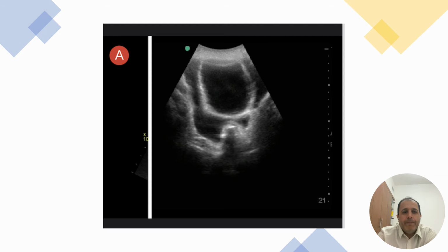So we should always check the bladder in two views, sagittal and transverse. If you only do transverse, there is a chance of missing mild free fluid, so we should check behind the bladder and sweep the transducer to check all parts of the bladder, from anterior to posterior and from right to left.